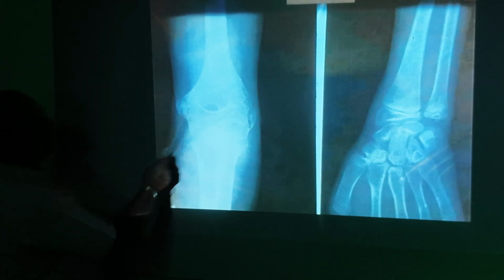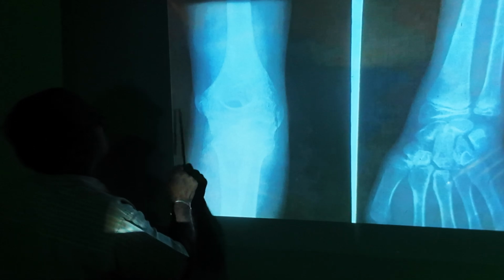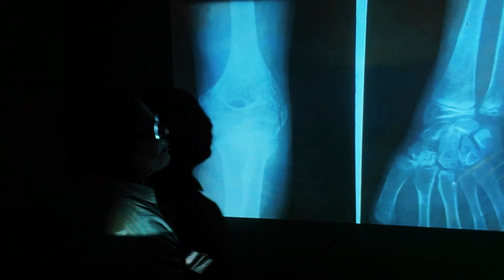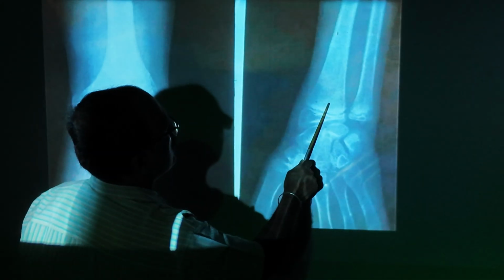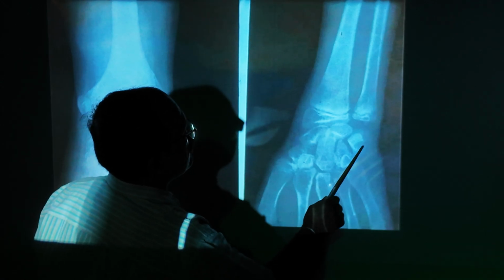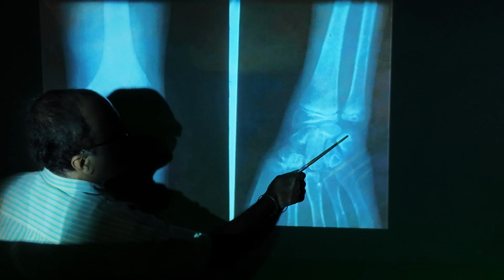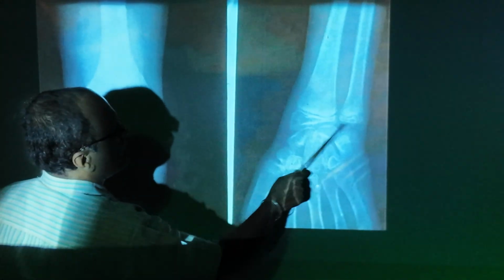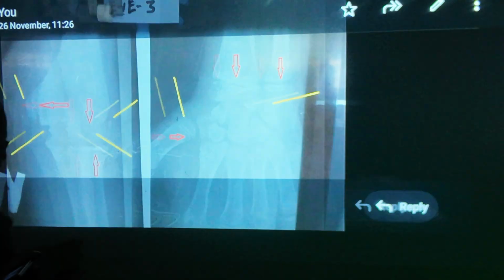You can see, this X-ray is not good. Okay. You can see the lower end of ulna, lower end of radius, pisiform bone you are expecting here. If it appeared, it means 12 years. So lower end of the radius and ulna is not fused. Age less than 19 years.